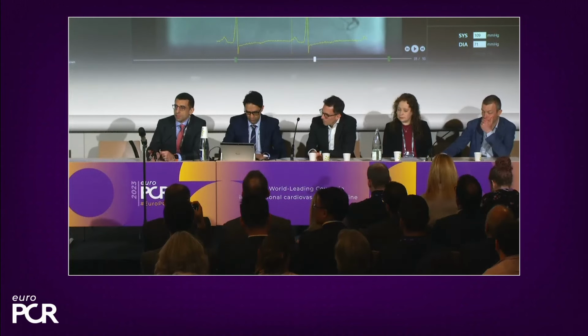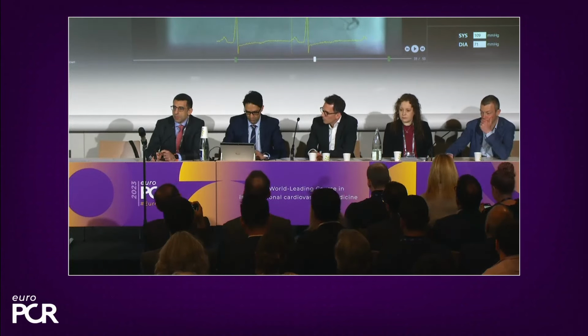And so you don't have to go to the very distal vessel to do the analysis. The most important thing was actually what Alessandra said: avoid a small vessel, less than 2 millimeters, and avoid also landing at a bifurcation. So if you have a bifurcation, please do it before. And I guess that with these two tips, you know that you have to avoid just these two things. For the rest, the measurement is reliable.